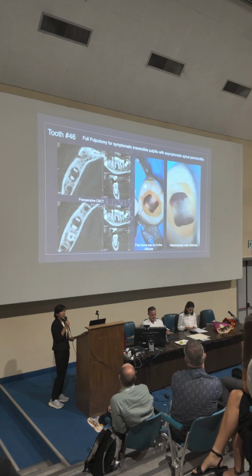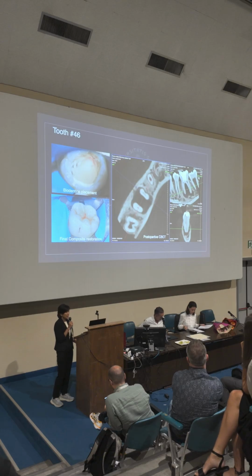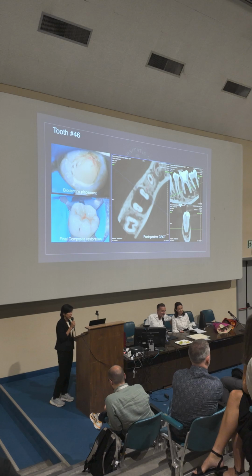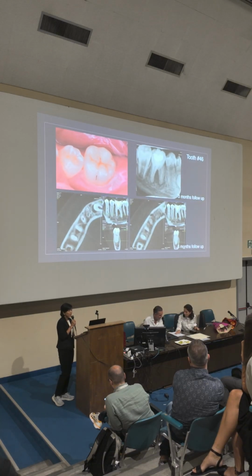After removing the coronal pulp tissues, hemostasis was achieved within 10 minutes. So I went forward with pulpotomy, and the Biodentine was placed, and after that the final restoration with composite. The direct composite restoration afforded the essential seal from both sides.